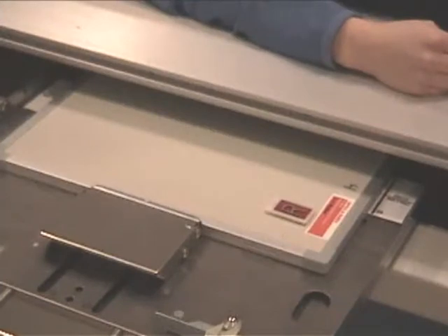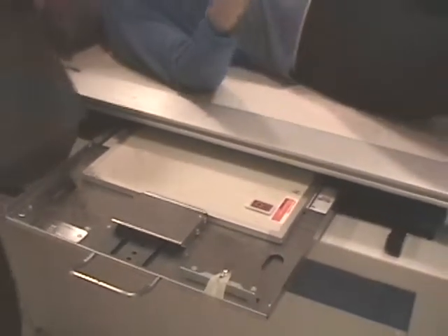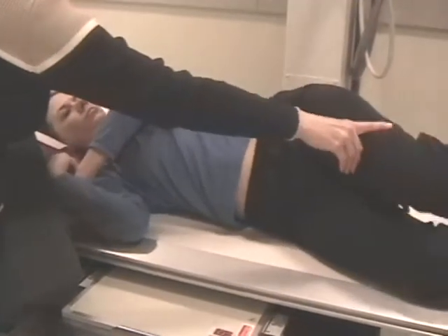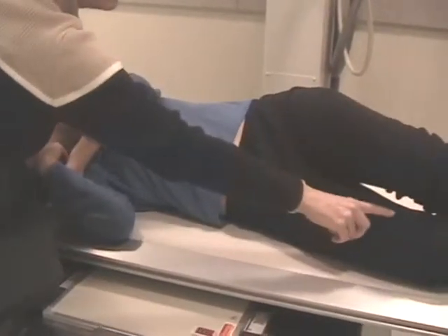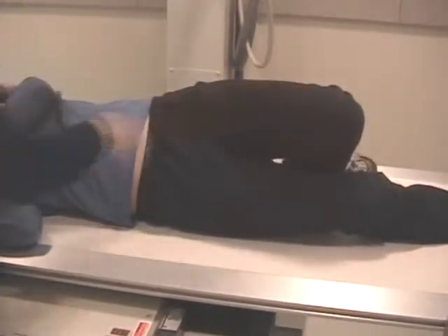The patient will be oblique to a 45-degree level. Okay? I'm going to have her reach this arm over her chest, bend this knee for support. Let's make this leg straight, more straight. This foot come back. There you go.